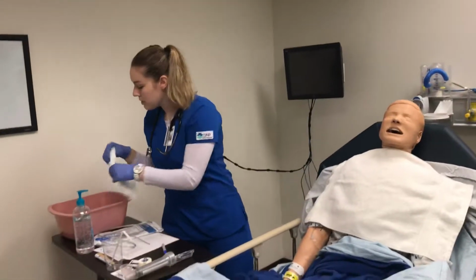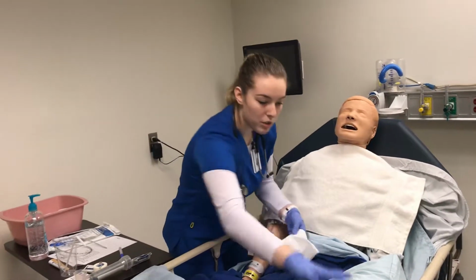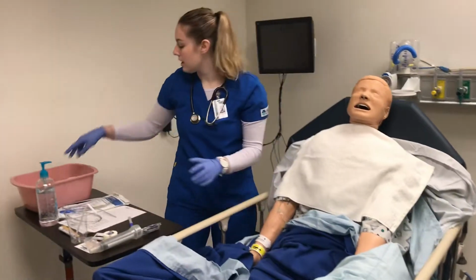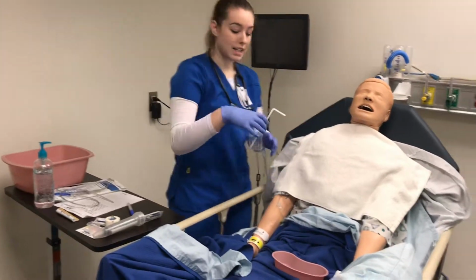Okay, Shirley, so I just have a towel here I'm going to drape across your chest. And then I also have some Kleenex for you, just in case your eyes start to water or your nose starts to drip, and you can wipe with that. And then I have a kidney basin for you. And I also have a glass of ice water.